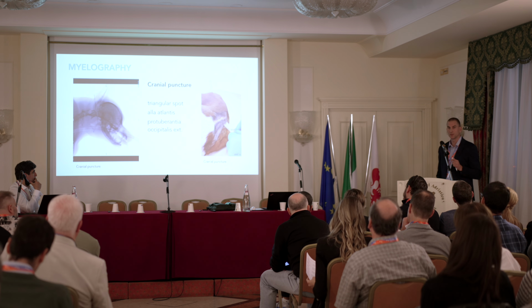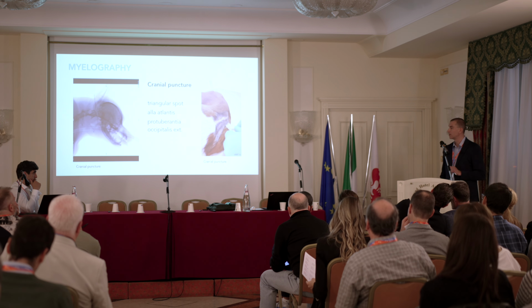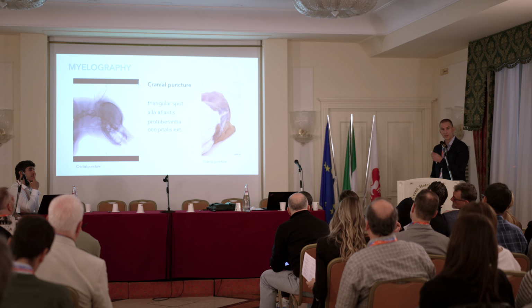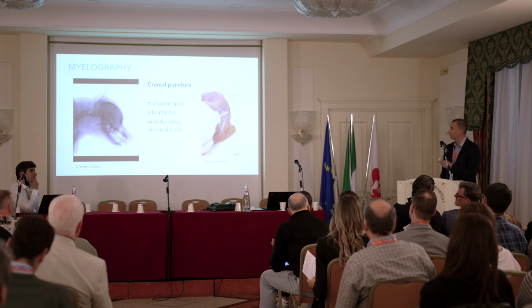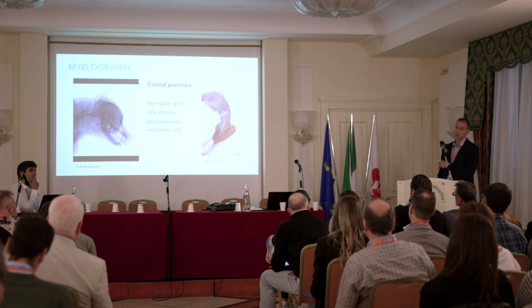Sometimes I send it to the lab, sometimes I throw it up because we don't use it, but before contrast medium application, it's necessary to have CSF. And the similar application, so if your needle is inside and you take out some amount of fluid, then you can apply the contrast medium.